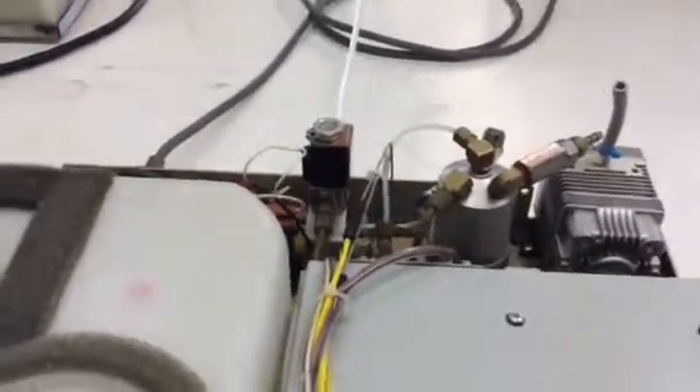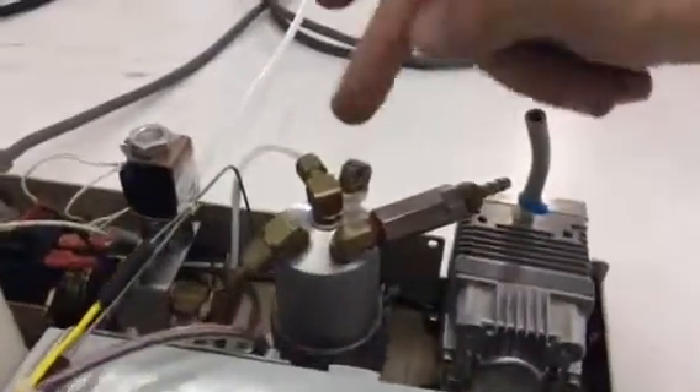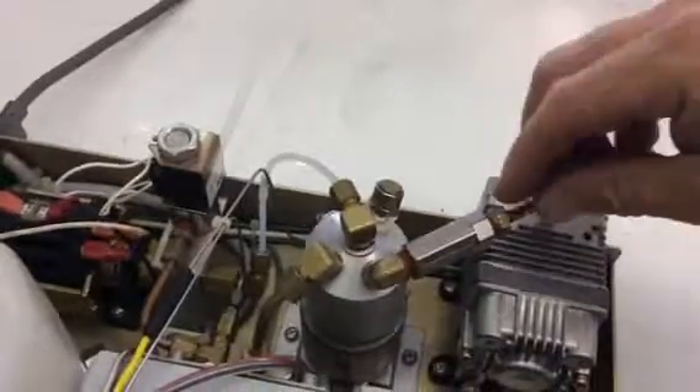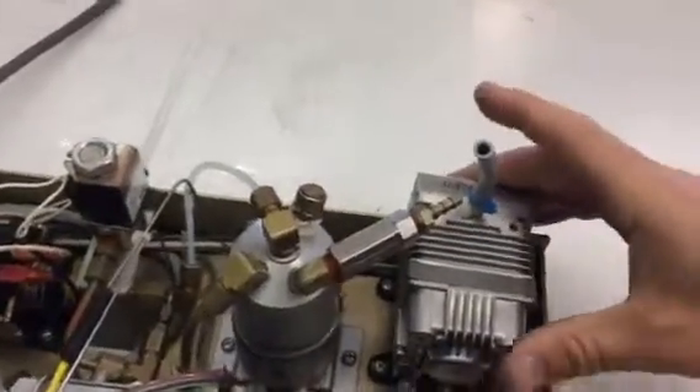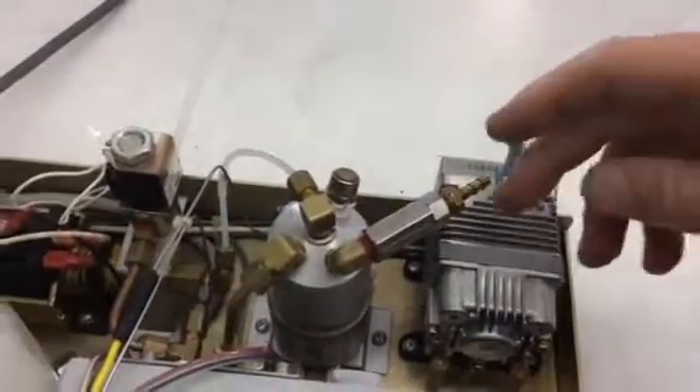The next thing would be to verify that the check valve, which is this, and the pressure relief valve, which is that, are not leaking. This check valve should be replaced every two years — it's in line to this air compressor. A way to test that, I can show you in another video, again on statumusa.com.